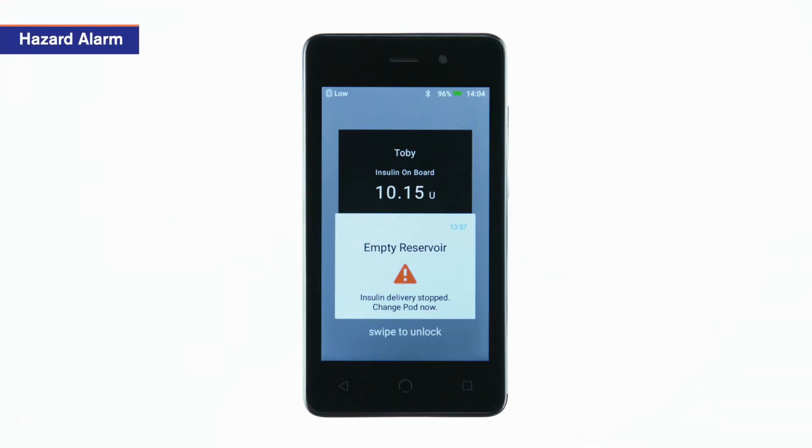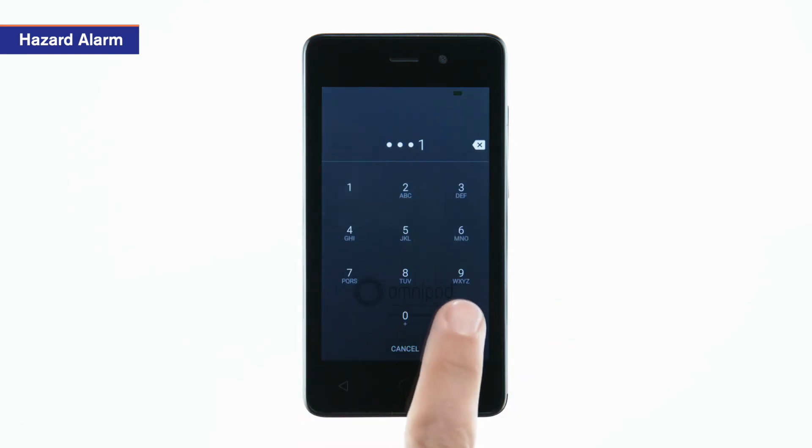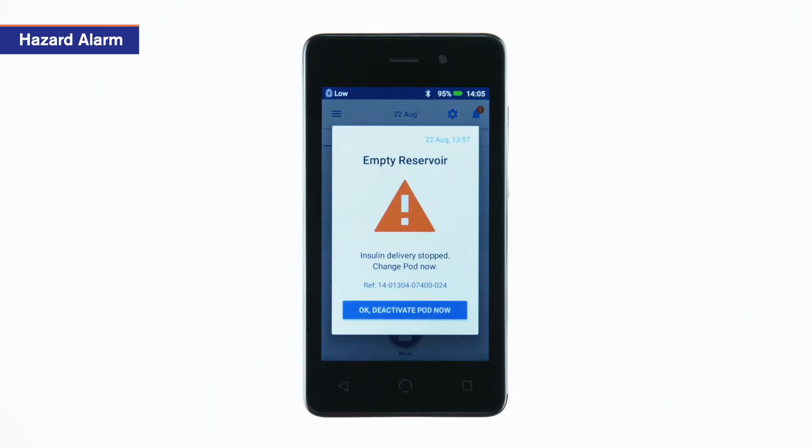Finally, you'll need to replace the pod if a pod hazard alarm occurs. During a hazard alarm, the PDM tells you to change the pod.